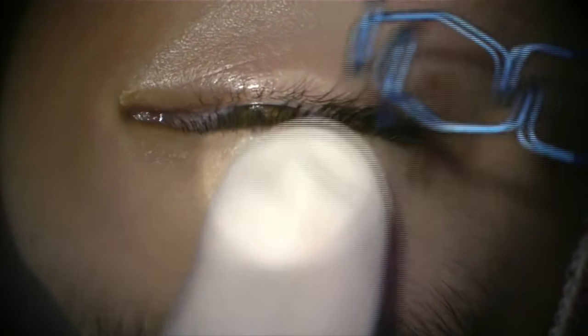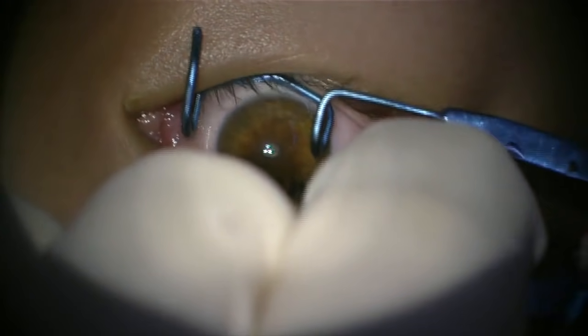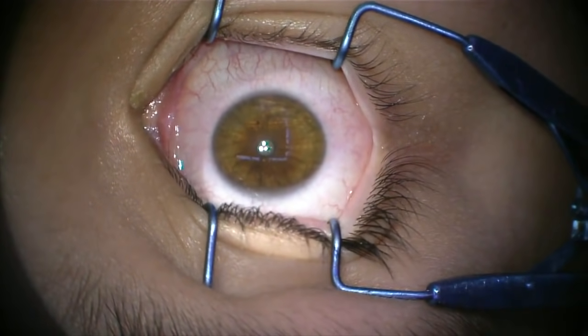This is the speculum being inserted into a patient's eye. Initially, the speculum feels uncomfortable in the eye, but after the patient adjusts, after about 20 to 30 seconds, it really isn't too uncomfortable at all.